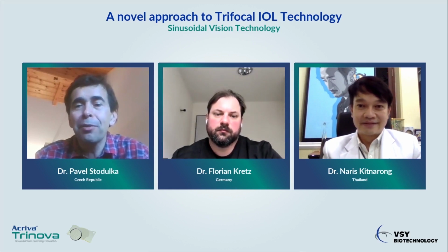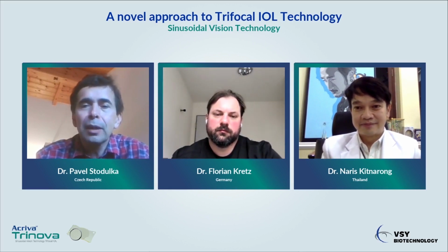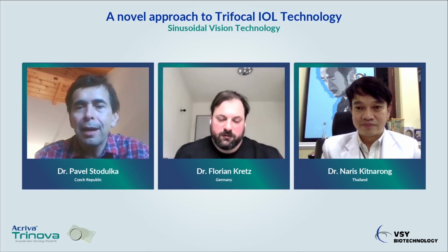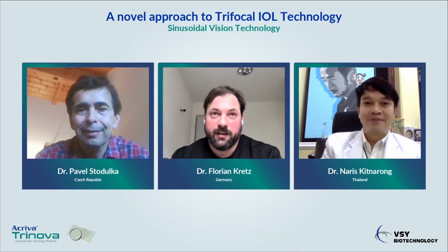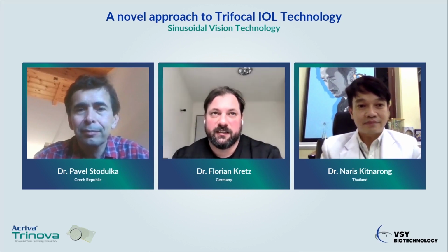The first question goes to Florian, and it's: did you experience less halo and glare with Acriva Trinova compared to some other trifocal lenses? Thank you very much for the question, Pavel. Yes, we did. If we look at the outcomes for the Trinova compared to other trifocals, it especially has less distinct halo due to the lesser amount of rings.